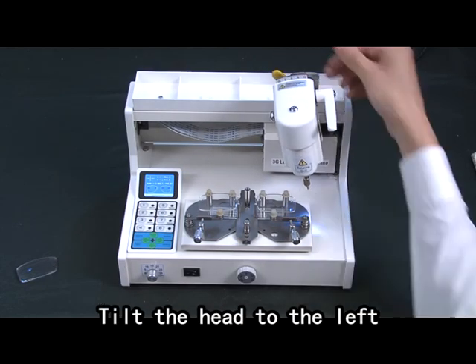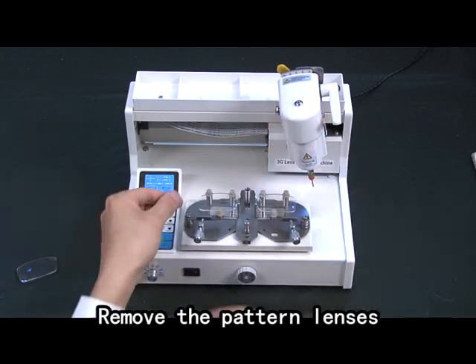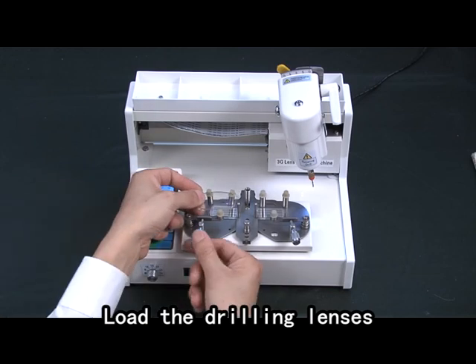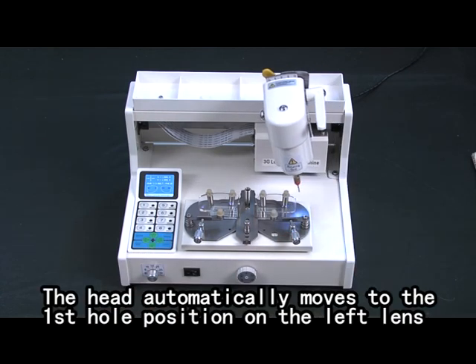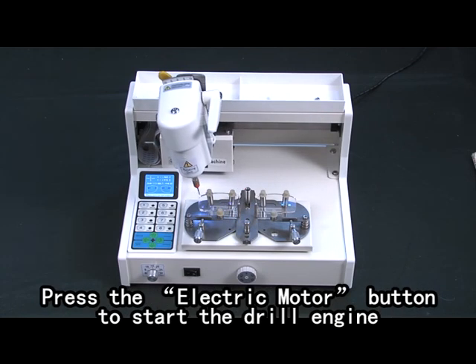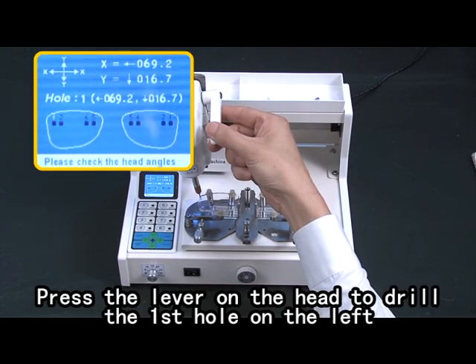Tilt the head to the left. Remove the measuring probe. Load the right type of drill bit. Remove the pattern lenses. Load the drilling lenses. Press the confirmation button. The head automatically moves to the first hole position on the left lens. Press the electric motor button to start the drill engine. Adjust the spindle speed control to the desired speed.